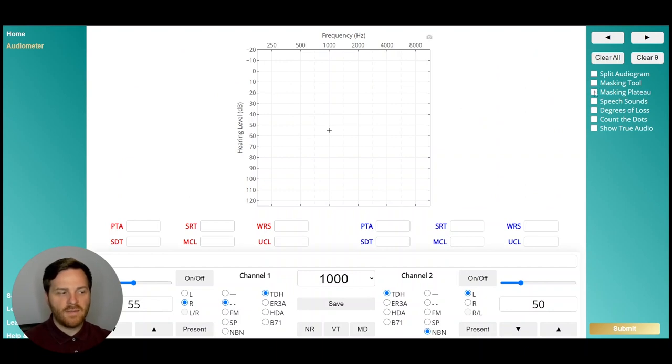The masking tool and the masking plateau are just different ways to help you understand masking. They're great educational tools, and we have a whole video that introduces those tools that I recommend you check out. Here you can also see the speech sounds overlaid on the audiogram as you do your testing, and you can see the degrees of loss as well. In addition, we have a count the dots feature that puts the count the dots audiogram onto the screen so you can get an estimate of the articulation index.